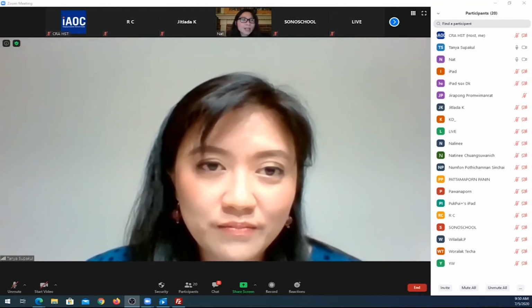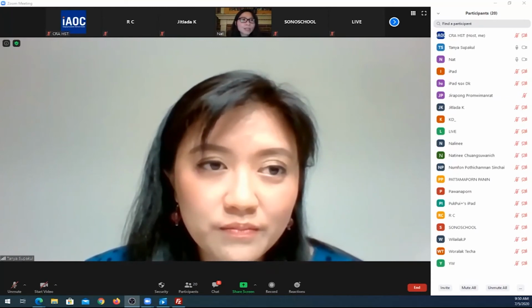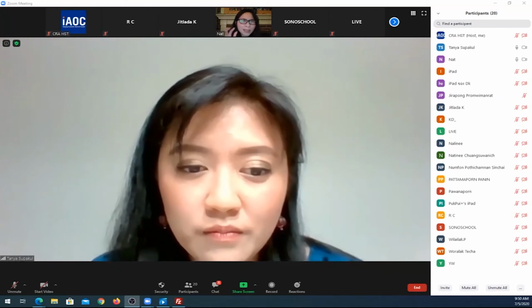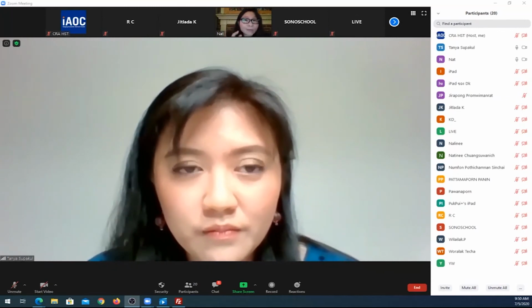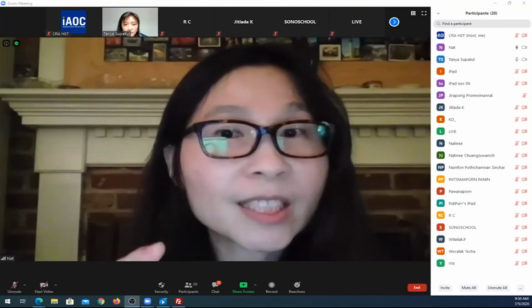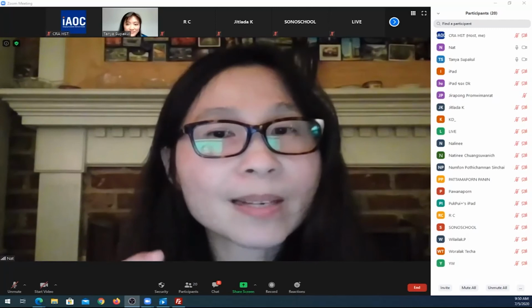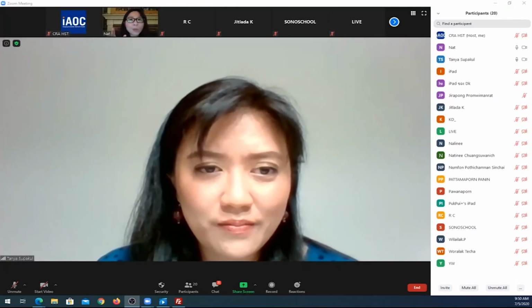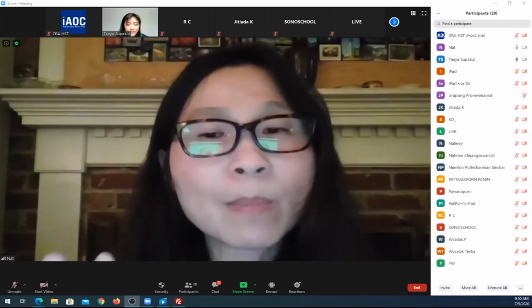Right now we have started doing it here, but not in every case. Most of the time we will get a good enhancement. For me, it helps just a little bit in case we did not get a good study. If the technology is really good, you always get a good enhancement, except when the patient's cardiac output is just so low, and that one you cannot predict. That one may be where it can help.